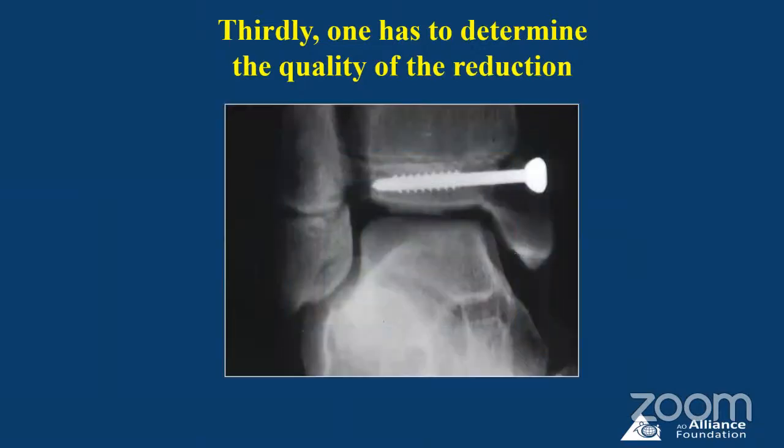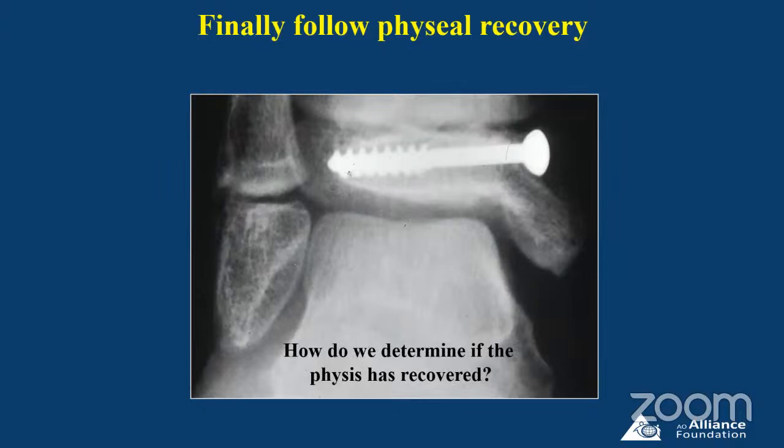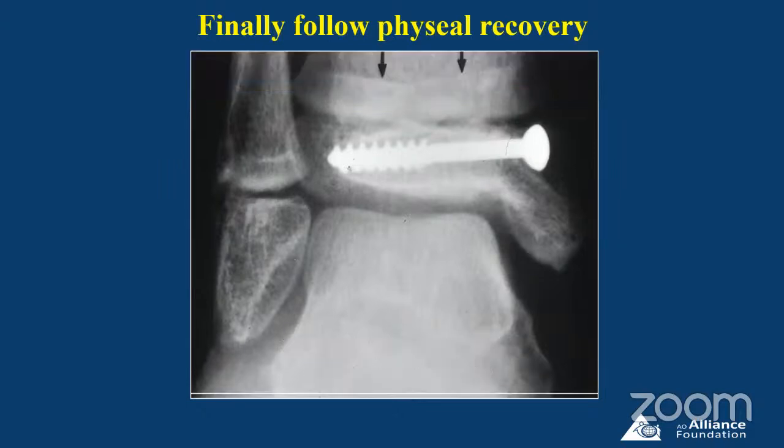You need to do an arthrogram. So you do an arthrogram, put a little dye, and look at the quality of reduction. And then you do a little stress examination. After the medial screw, apply a varus force. If the fibular fracture opens up, then you may put a K-wire here for temporary stabilization. If it doesn't, you may just cast it. And finally, you follow till physeal injury heals.